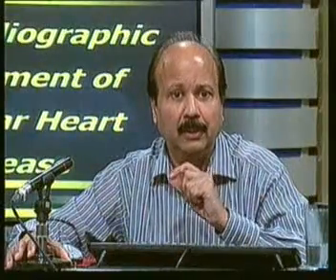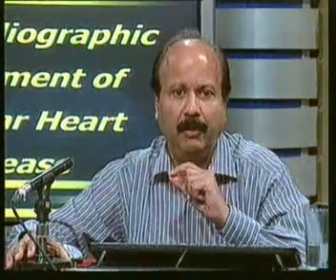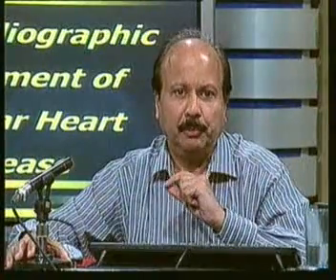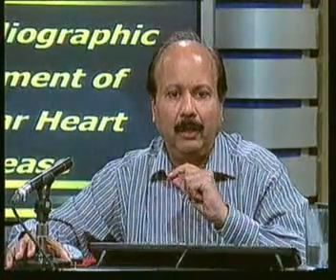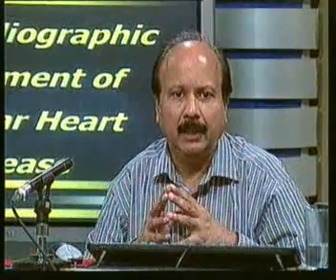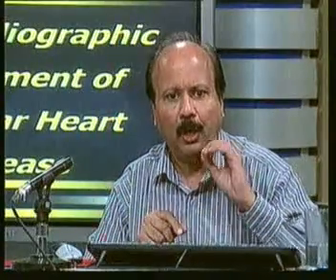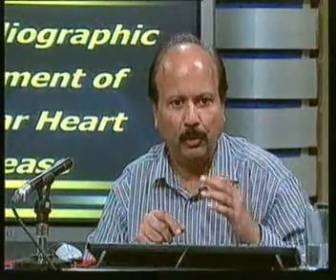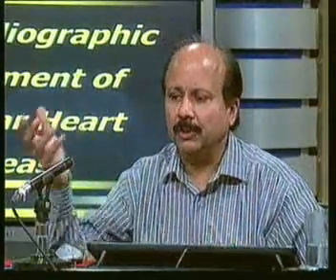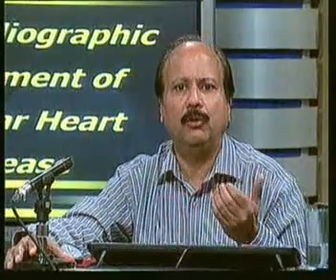The reason is all these things give you detailed information about what you are looking at, what the valve will be like, and what you anticipate. So don't just think that when we talk of echocardiographic assessment of valvular disease, the first thing we will do is put the transducer on the patient's chest. It has to be goal oriented. You have to know what you are looking at. And having said that, of course, there will be surprises, which you will take in your stride. However, you must know why you are doing the examination.